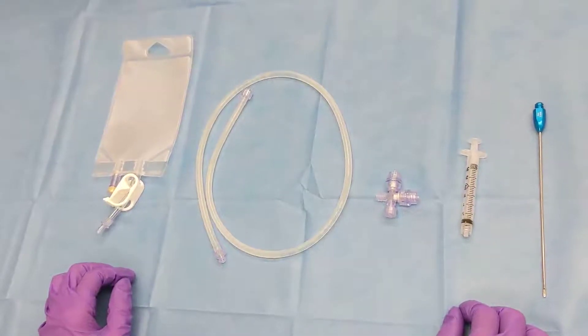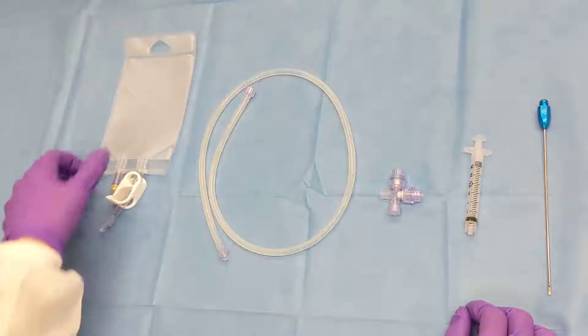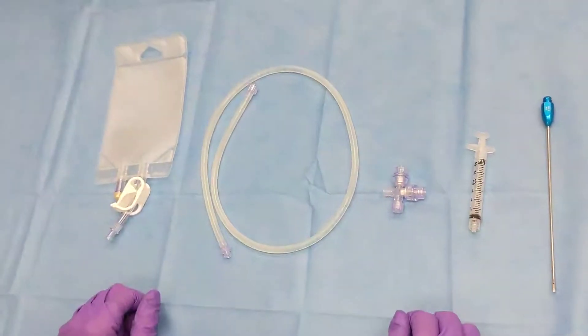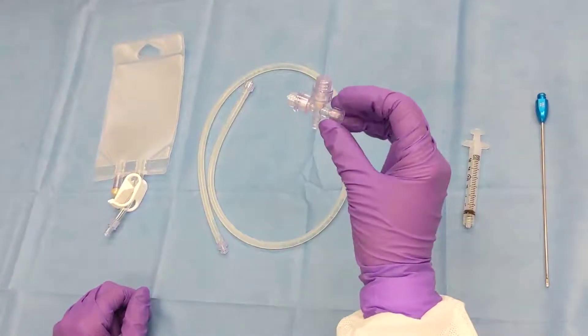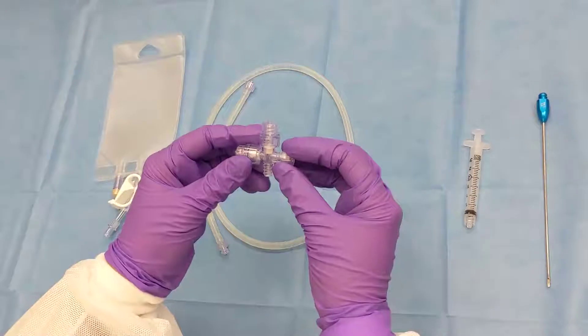Once harvesting is complete, we'll then move into grafting mode for a lipografter. Make sure the clip is sealed shut for the storage bag. You'll then take your AT valve and remove all components from the valve.